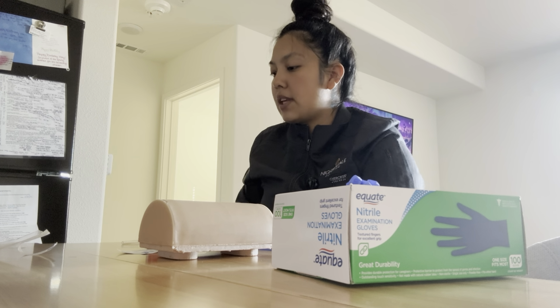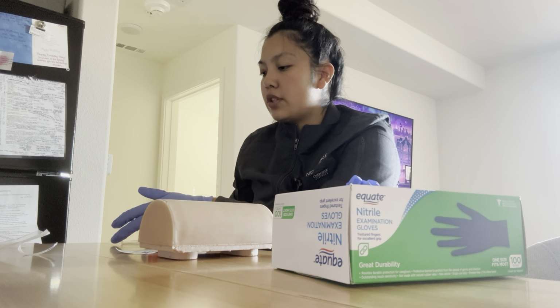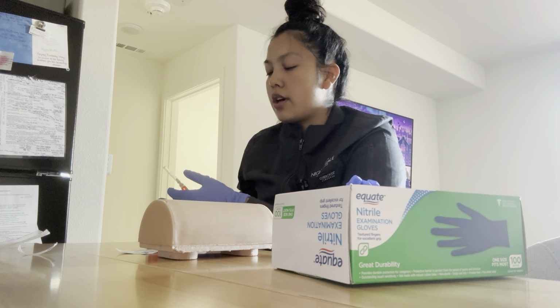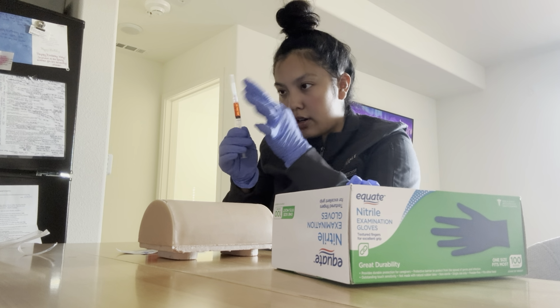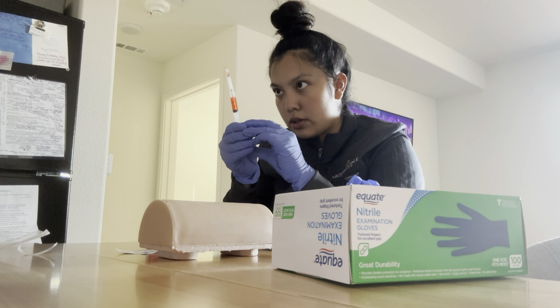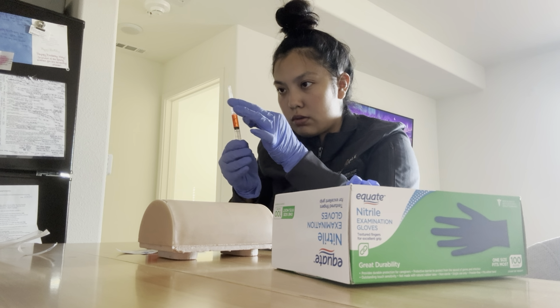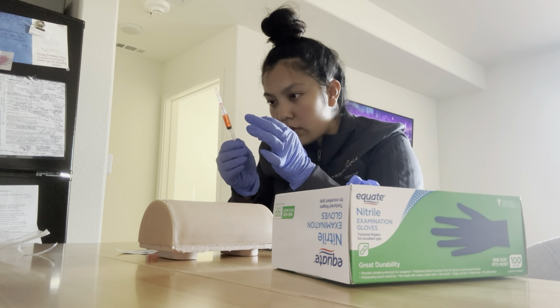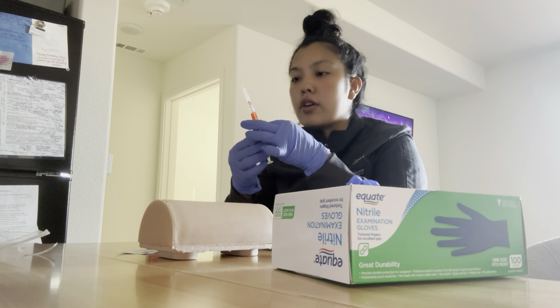I'm going to recap this by the scoop method, and once it's scooped back in, I'm going to close it up. Make sure that there are no air bubbles. Perfect, there are no air bubbles.